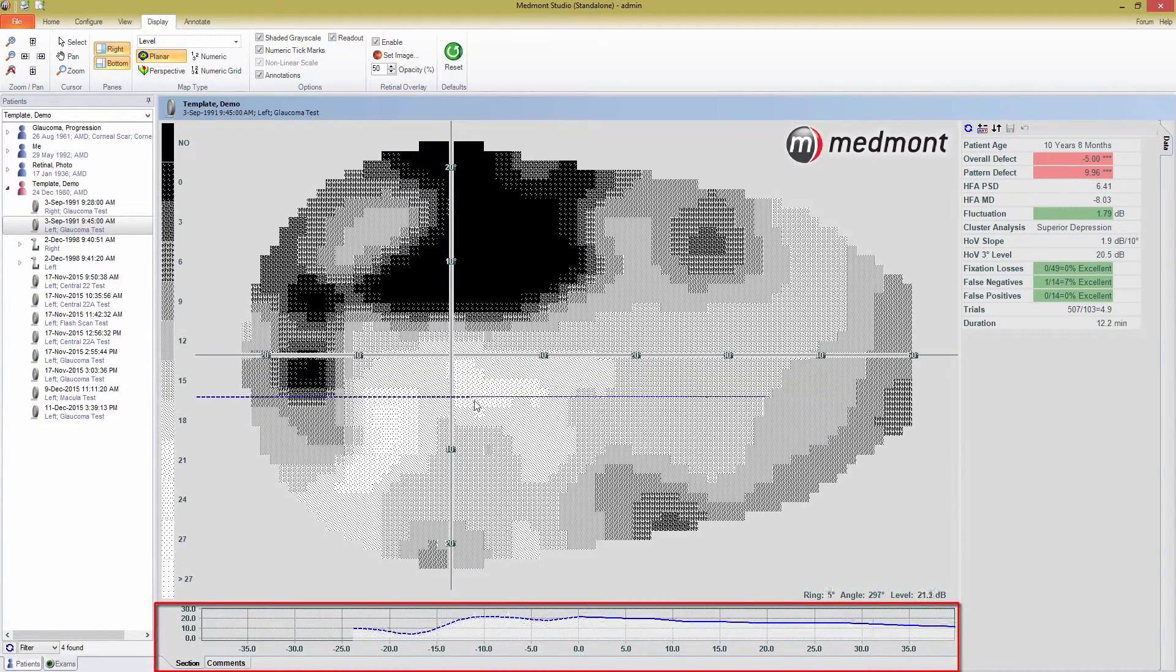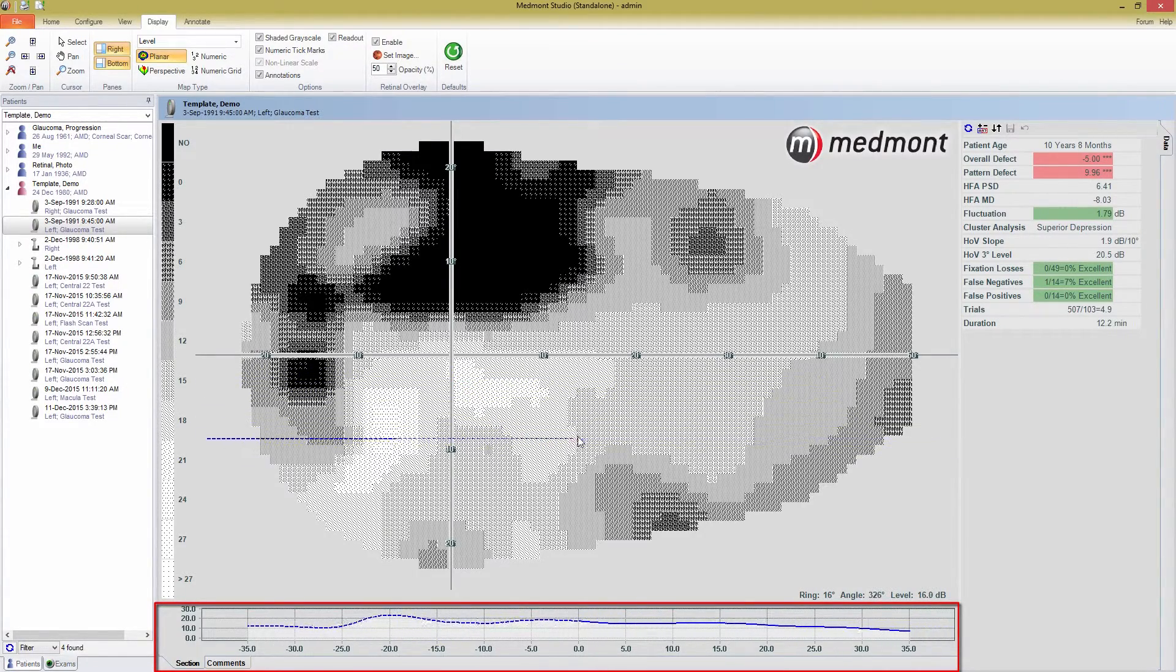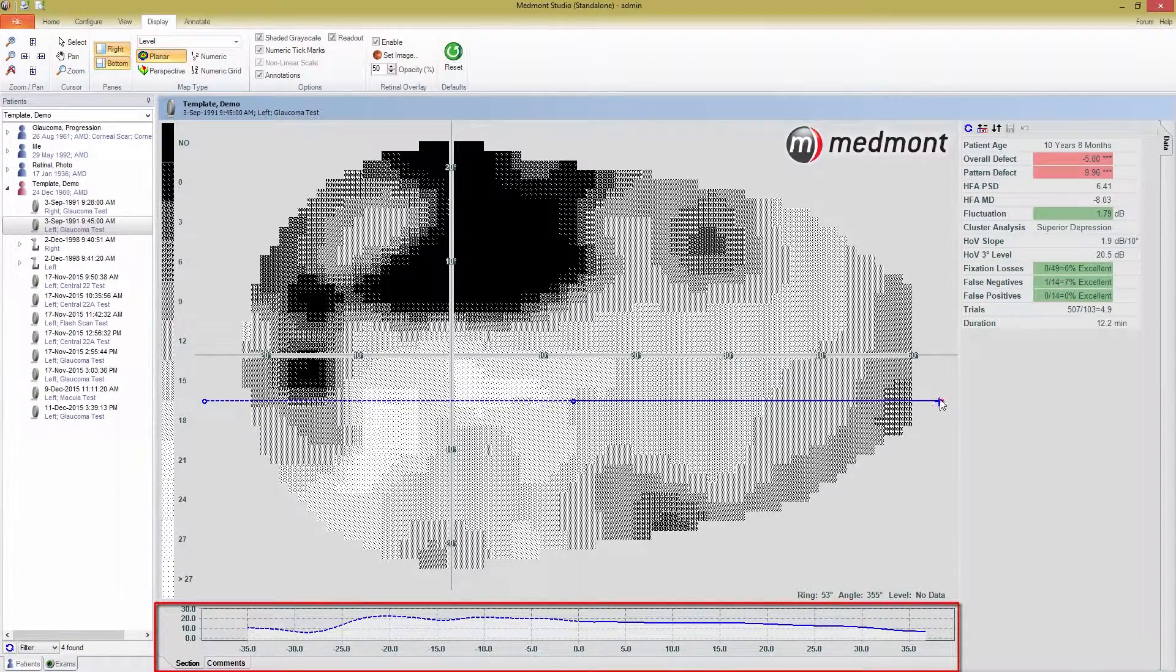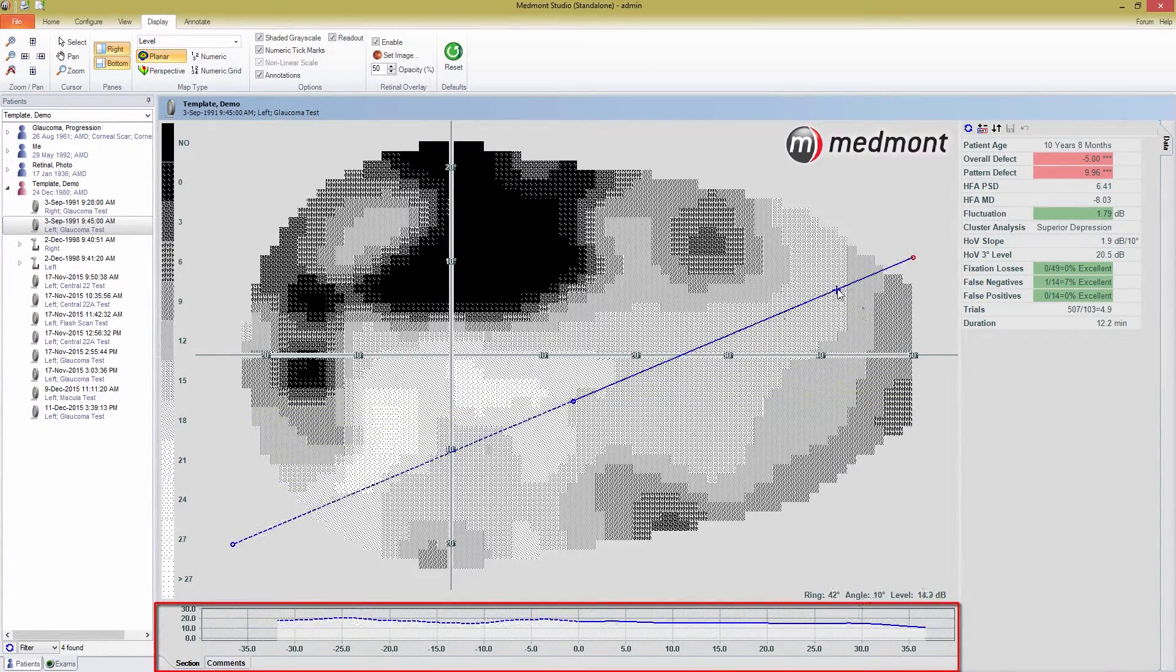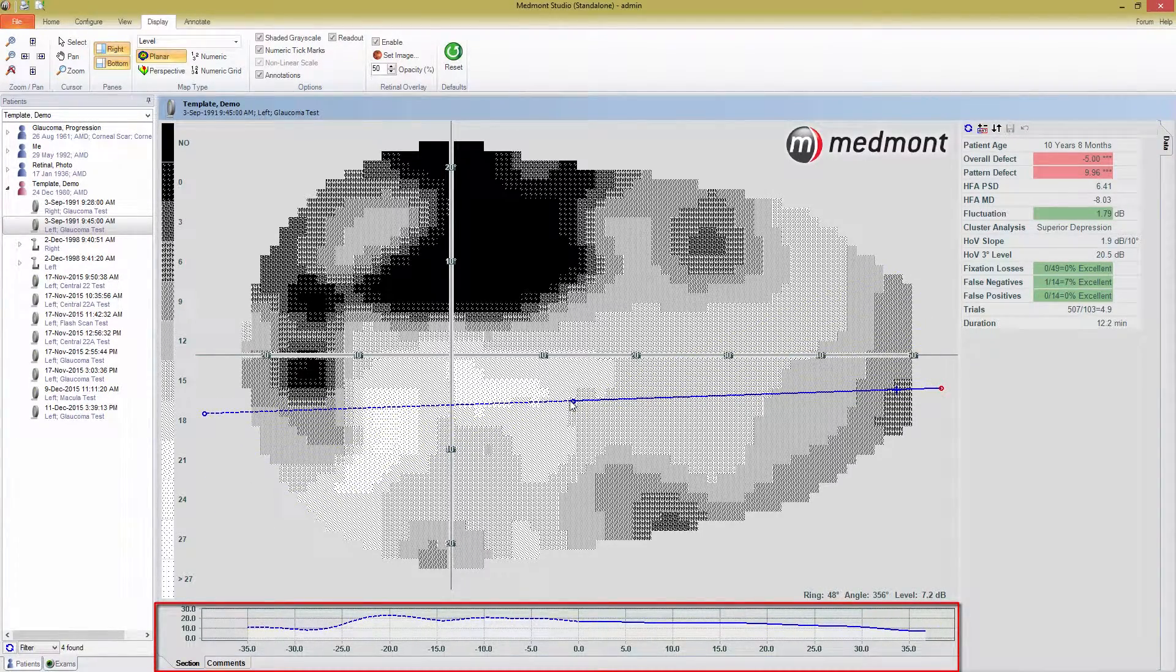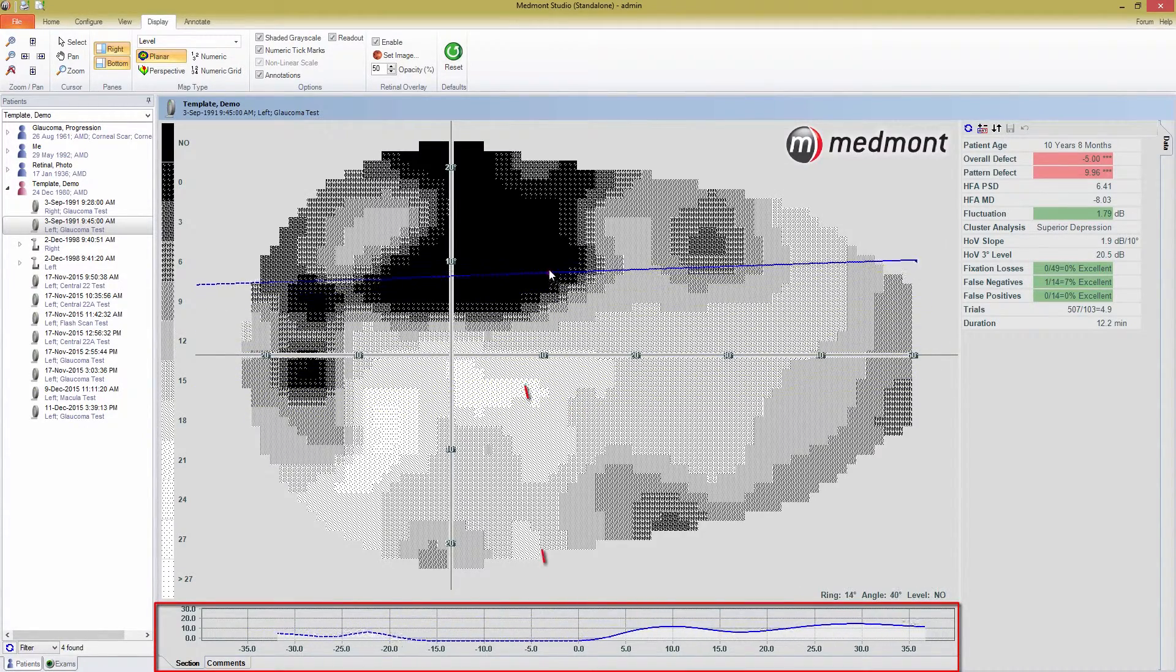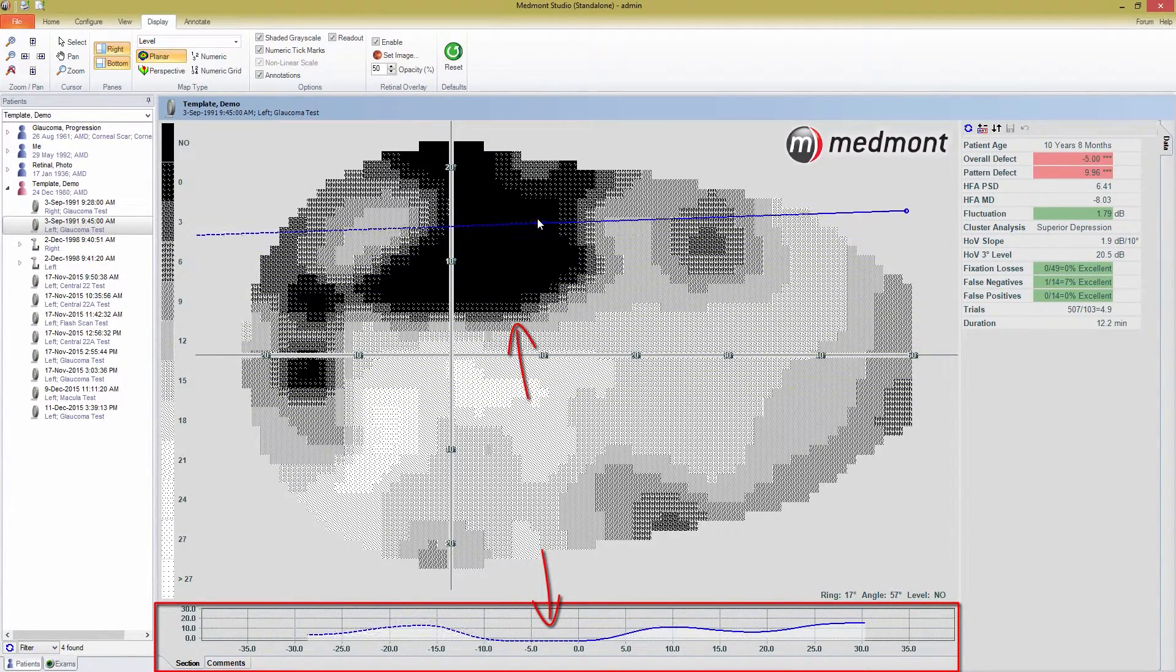You can move it side to side by clicking anywhere in the center of the bar, and you can rotate it by pressing on the small circle at the end. Notice that if I drag the cross section to intersect this scotoma, you see the dip in the visual field represented in the graph down here.